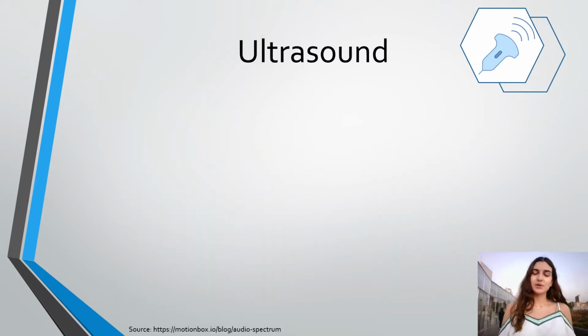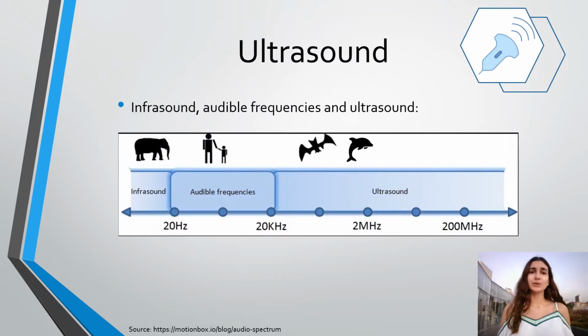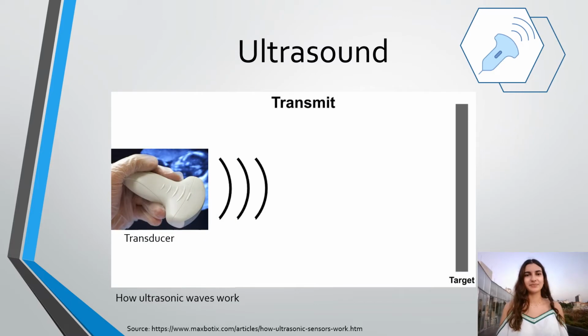We may assume we have good hearing, but our ears can only detect a small range of frequencies. Ultrasounds can be heard by bats, dolphins, and other animals, which is beyond the frequency that humans can hear. Let's explore ultrasound and how it operates.